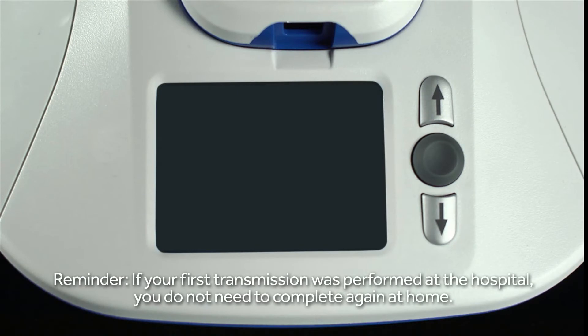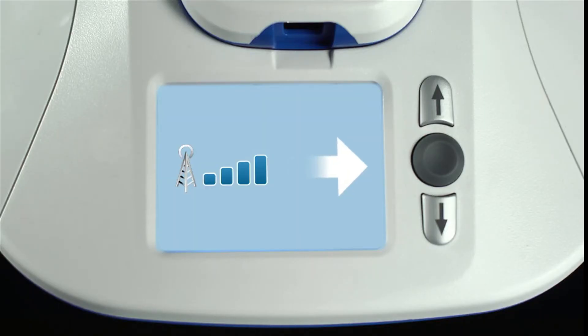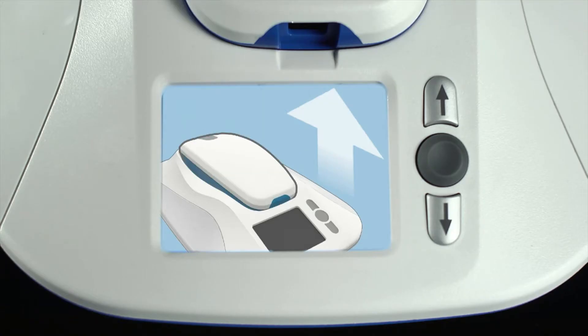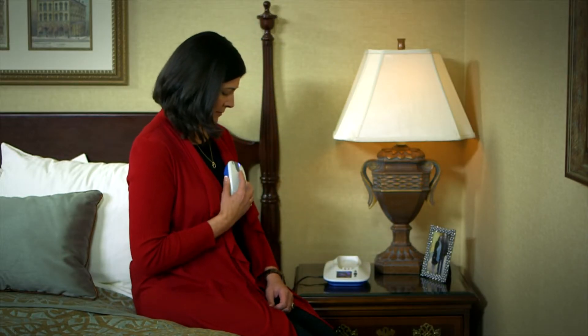If the monitor screen is dark, begin your manual transmission by pressing the round, gray button just once to wake it up. When you see this screen with a white arrow, you're ready to begin. Now push the gray button once more to begin sending the transmission. Lift the reader from the base and hold it over your RevealLink ICM.